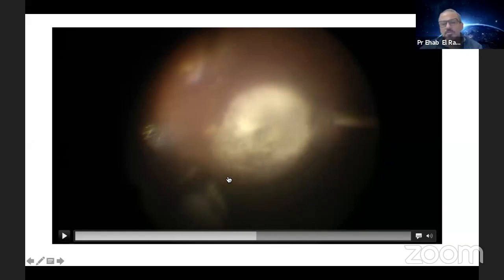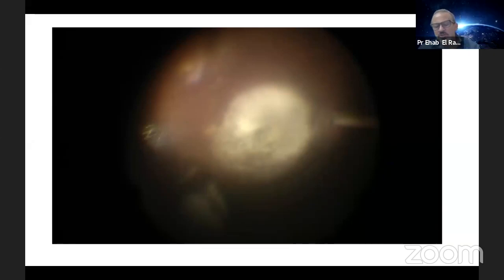Well, usually you can do it with the vitrectomy cutter by itself. Just gentle aspiration at the upper edge of the disc. You can actually detach it. And sometimes, as you just mentioned, if you can't do it, you might even need to do it mechanically or grab it with a forceps or just a pick. The turbulence of the fluid, over time, if you keep doing a vitrectomy, the fluid itself finds its way and pops it off the retinal surface.